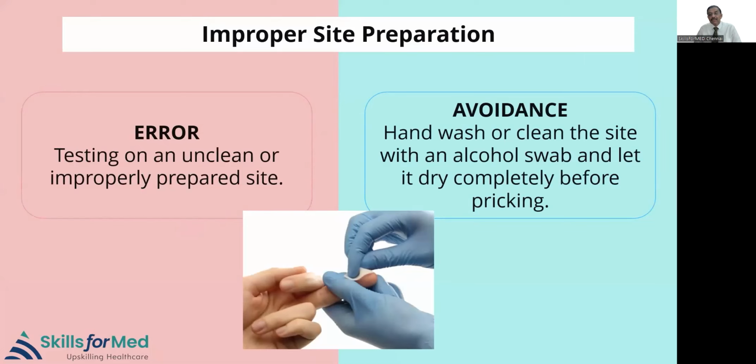So I ask the patient to hand wash if their hand is soiled, or clean the site with an alcohol swab. Let it completely dry before doing the pricking with the lancet. So that is about improper site preparation.